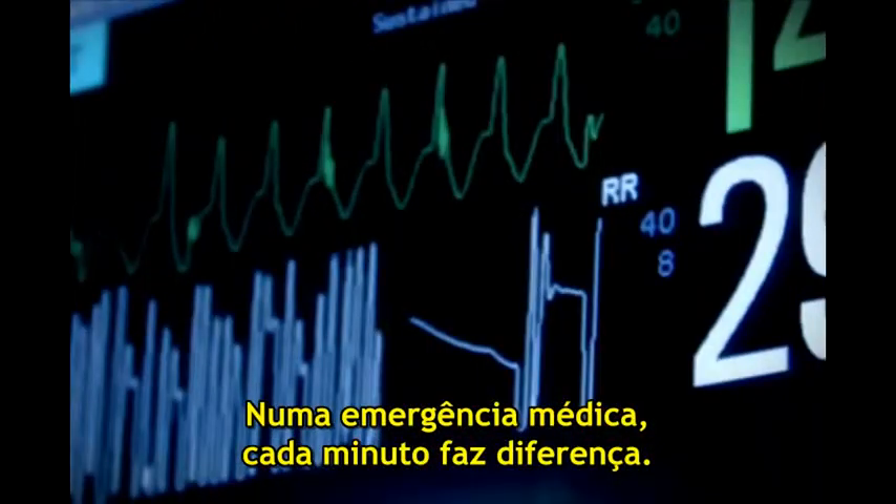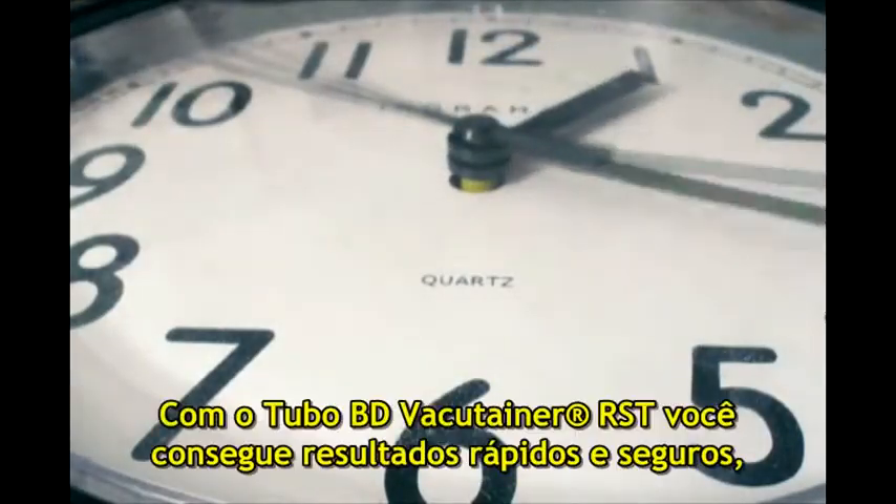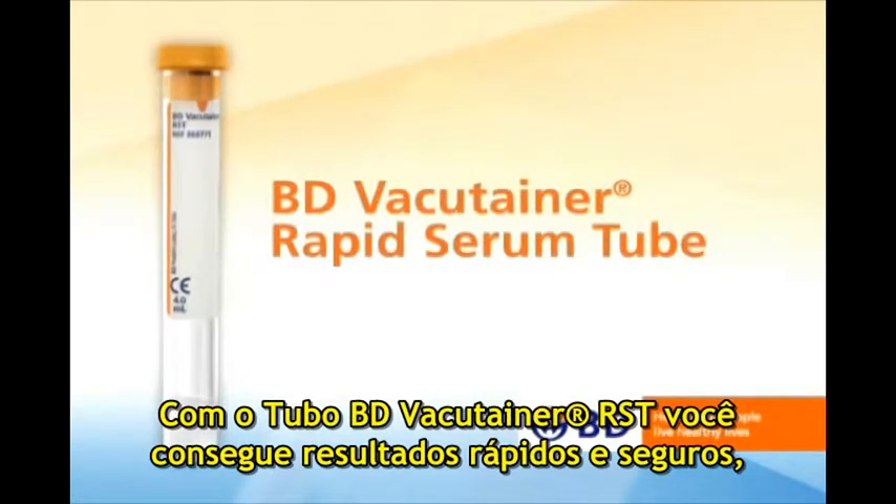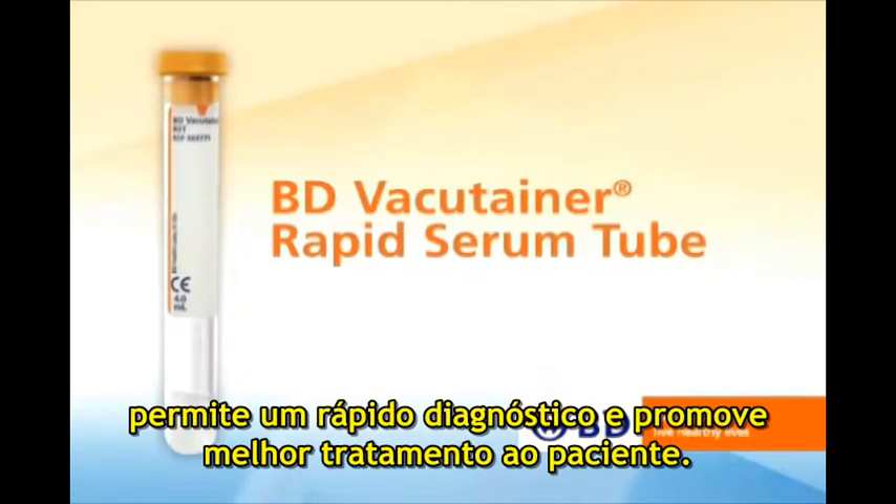When medical emergencies arise, every minute counts. And with the BD VacuTainer Rapid Serum Tube, you can count on fast, accurate results, allowing for quicker diagnosis and improved patient care.